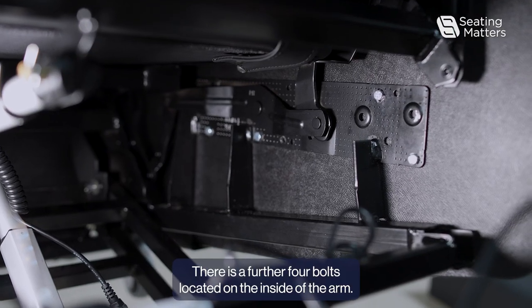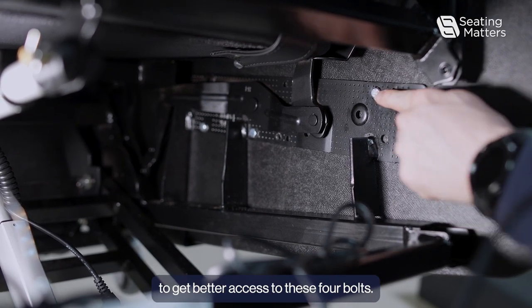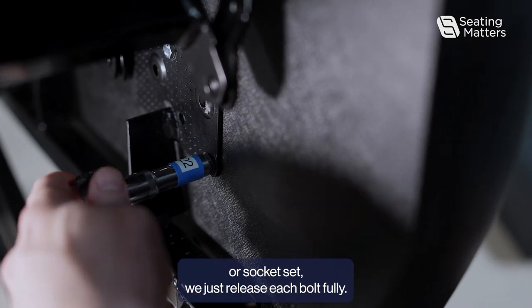There are a further four bolts located on the inside of the arm, and if you raise the chair up, it allows you to get better access to these four bolts. Using a 10 millimeter spanner or socket set, just release each bolt fully.